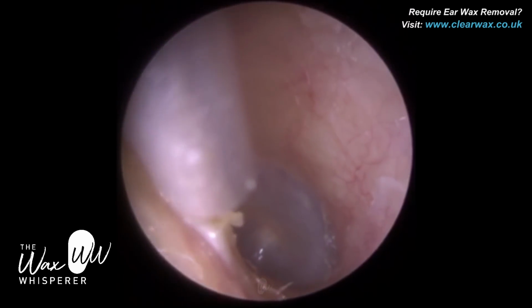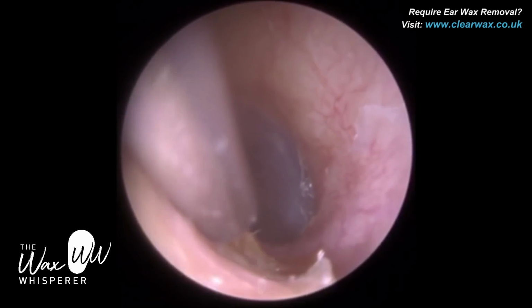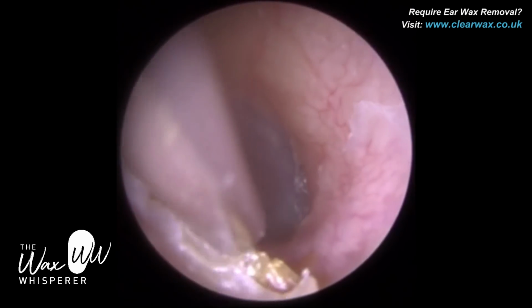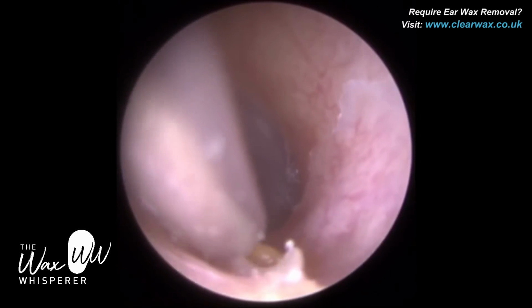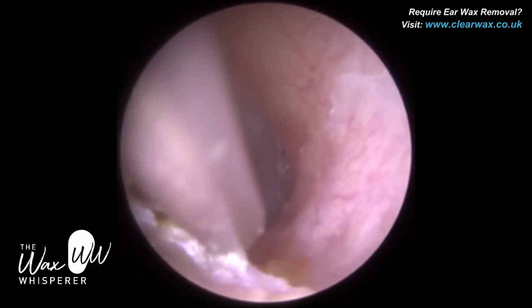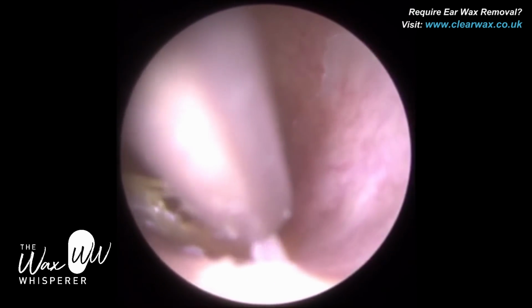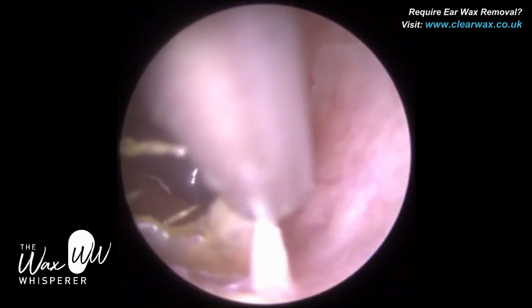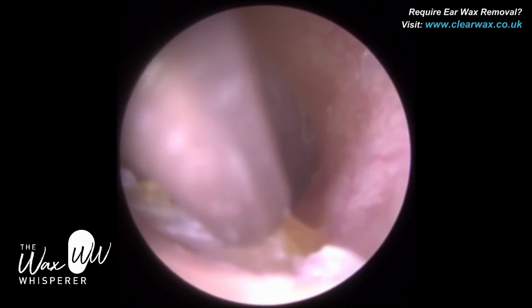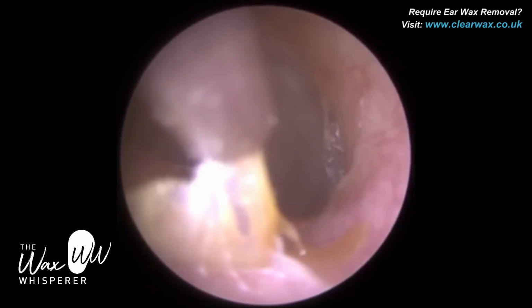Okay, if you're an ENT specialist who uses endoscopes already, fine, I totally get that. I'm not going to teach an ENT specialist who uses endoscopes already how to suck eggs. But having said that, we've had a few ENT specialists come on the course. Even one of our old directors, Darius Rajali, one of our co-founders, he'd be the first to admit, yes, there's a different skill using a rigid endoscope in a patient who's awake. So typically, so Mr Rajali, this is his own analysis really. When you're performing endoscopic ear surgery, the patient's asleep, typically, if you're using GA.